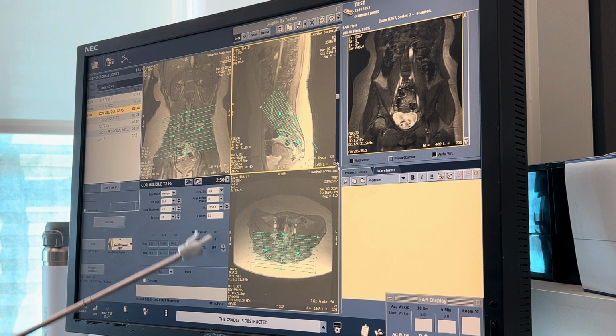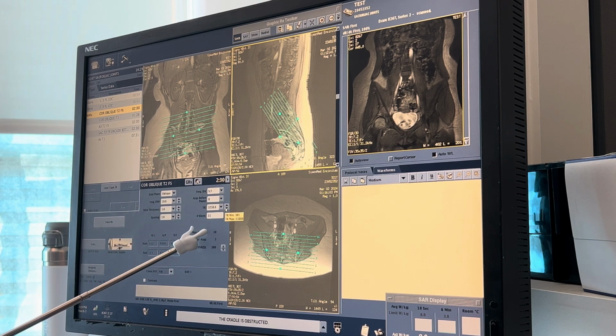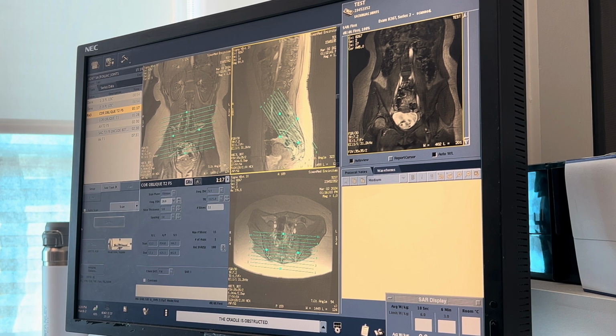So now let's do our TR. We have 2 times 10 is 20 slices worth of TR. We only need 11. So I want you to adjust your TR, knowing that that only adjusts this top number. The second number changes according to this one. So if you want to go from 10 to 11, do you go down or up? Down. Yeah, there you go, you go up. So keep going all the way until you get to 11 times 1. There you go, perfect. Okay, that's a very good time. Let's save that and auto scan.